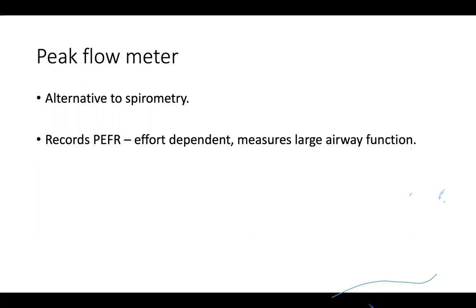The other thing in childhood and infancy is that FEV1 is a slightly difficult method, because most children have higher respiratory rates, so FEV1 constitutes most of the FVC. In these cases, the newer alternative is to use FEV in the first 0.5 seconds. This has slightly better sensitivity compared to FEV1 in children and infancy. So these are a few points I wanted to highlight.